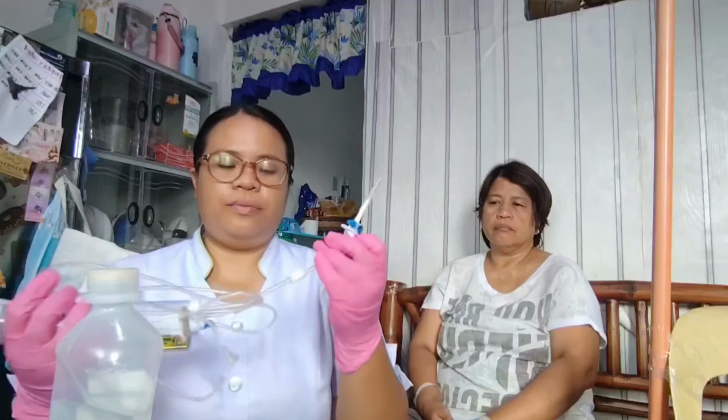Okay, so after closing, I'm going to insert the insertion spike into the prescribed IV fluid, which is 0.9% sodium chloride. Okay, so make sure to maintain sterility while performing this. So I'm going to now insert the insertion spike, so make sure to not handle this part.